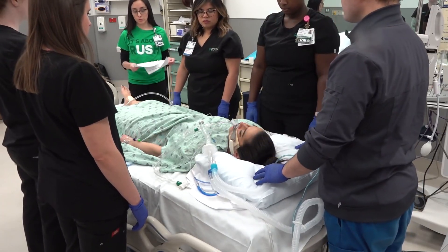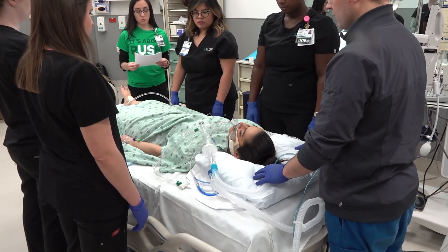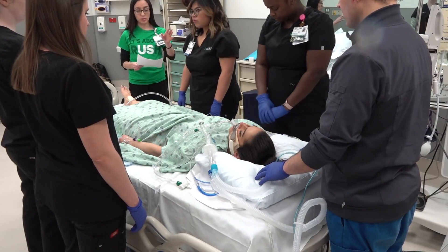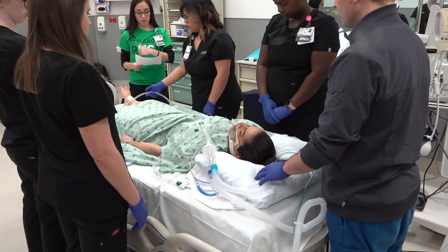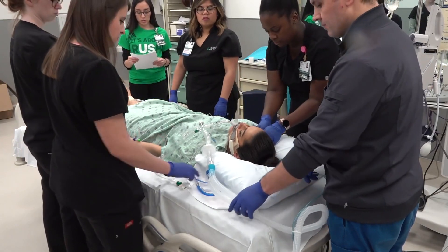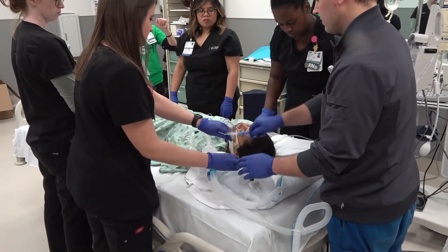Step one. We will ensure lines and tubes from the waist up are positioned toward the head of the bed, and lines and tubes from the waist down are positioned toward the foot of the bed. Ensure there is enough slack present between all lines, tubes, and monitoring equipment. This may entail bringing the IV pole and monitor closer to the patient's head of the bed.